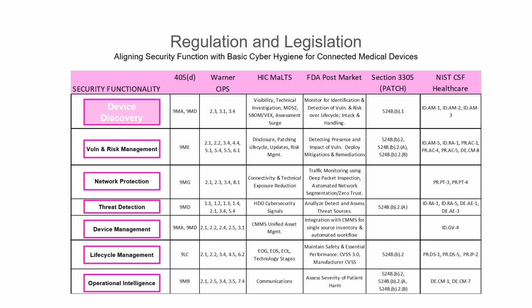So with the FDA, we basically stop the water from coming into the boat, the new risk from coming into the hospital. That's the idea here: transfer the responsibility of security onto the manufacturer, and have liability there. That also goes with the White House's national cybersecurity strategy. I don't have anything up here on it, but just off the top of my head, the strategy that just came out has 5 pillars, if I remember correctly. One: defend critical infrastructure, cybersecurity for critical infrastructures, which healthcare is one of.